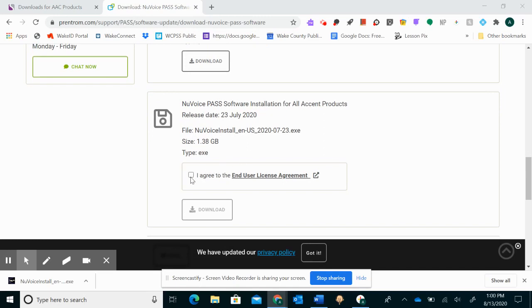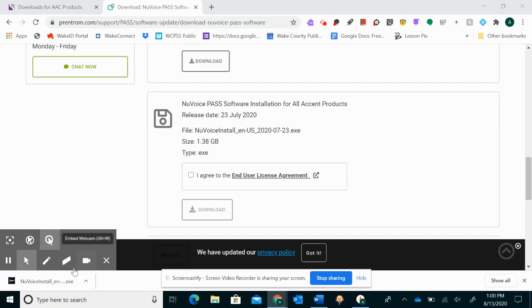You'll click agree and then download. Usually it takes around 15 to 20 minutes for the software to actually download. I already have it down here so I'm going to show you what it looks like once it's downloaded.